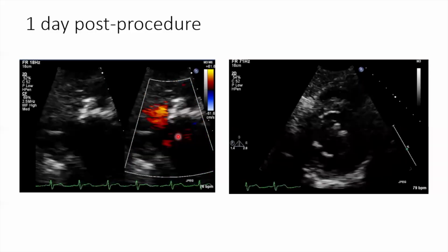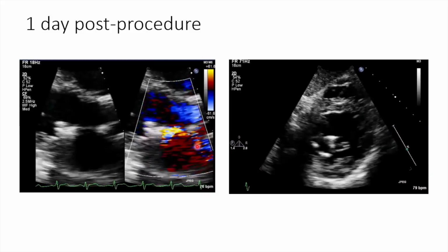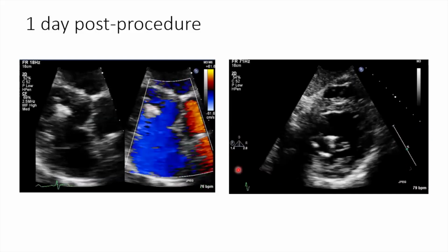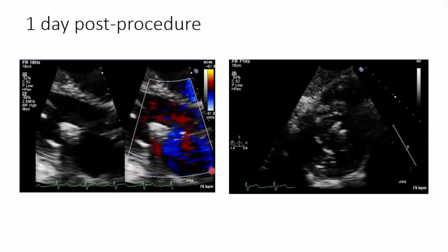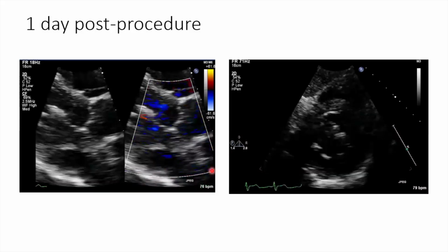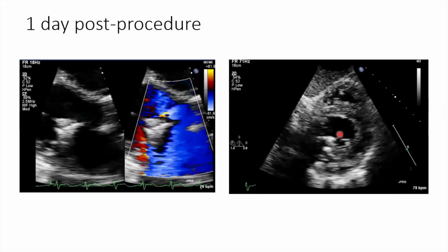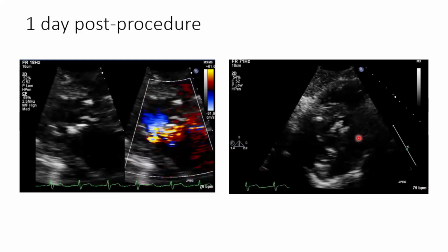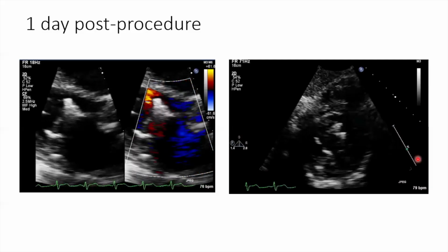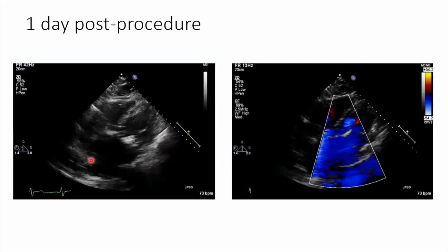And the mitral regurgitation is very eccentric and somewhat difficult to see. You really don't see the vena contracta or the PISA. There's certainly shadowing from the clips themselves, but it doesn't look severe. There seems to be reduction to at least moderate, mild to moderate. On the short axis, you can also see the leaflets and the clips themselves are still very mobile. It may be somewhat hard to appreciate their attachment to the posterior leaflets, but I think it's probably better shown in that sweep of the parasternal long axis.